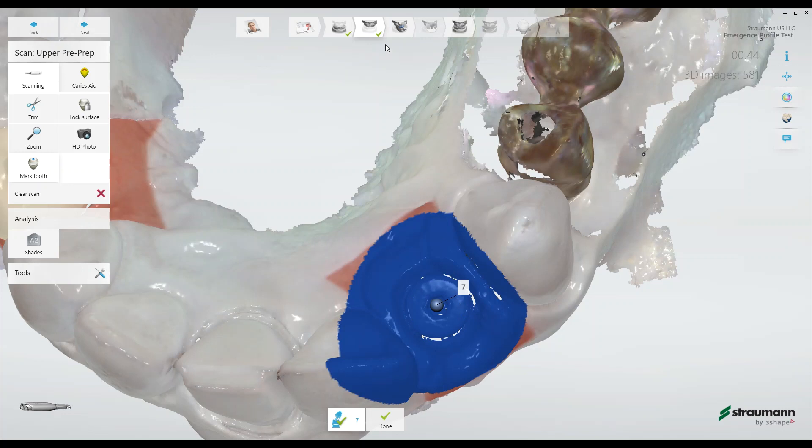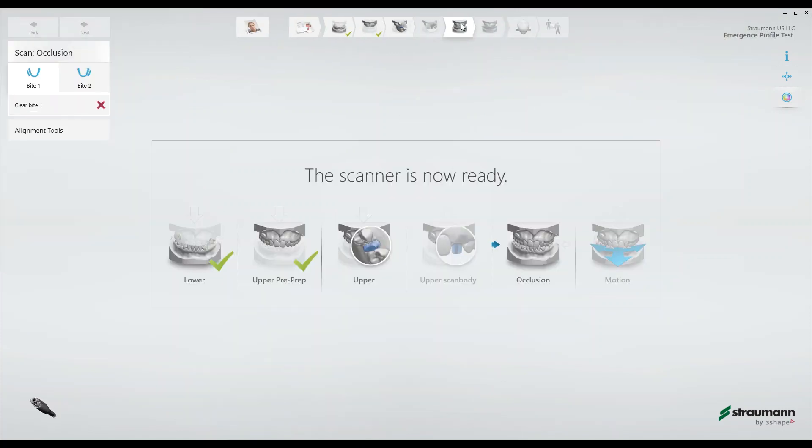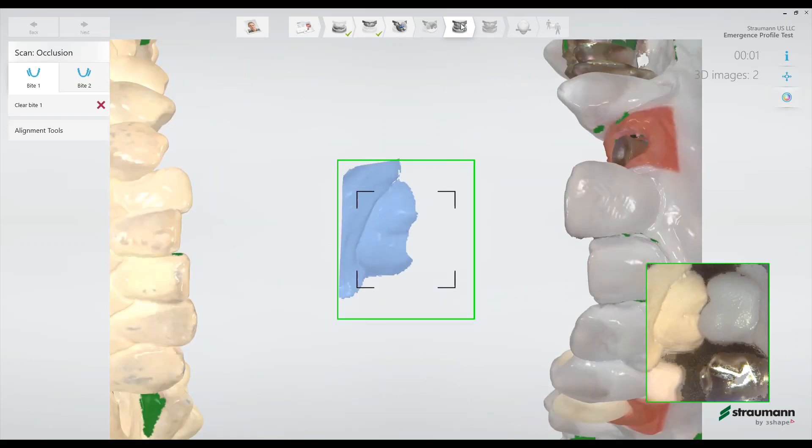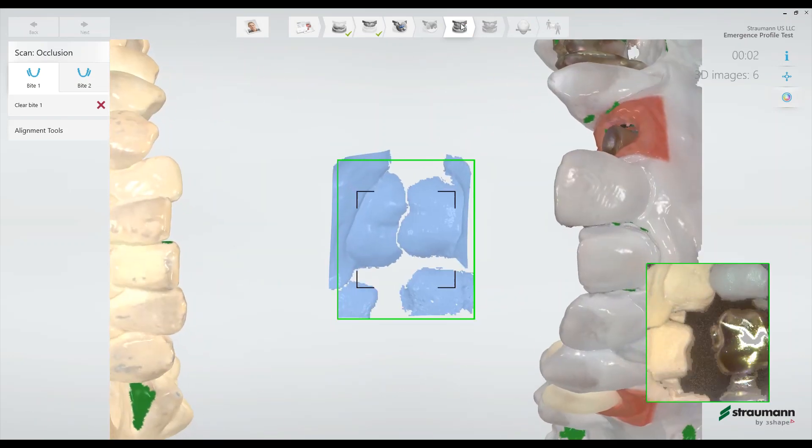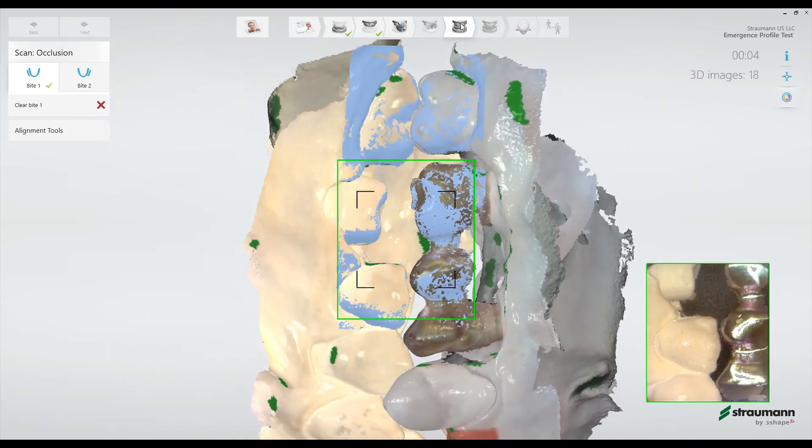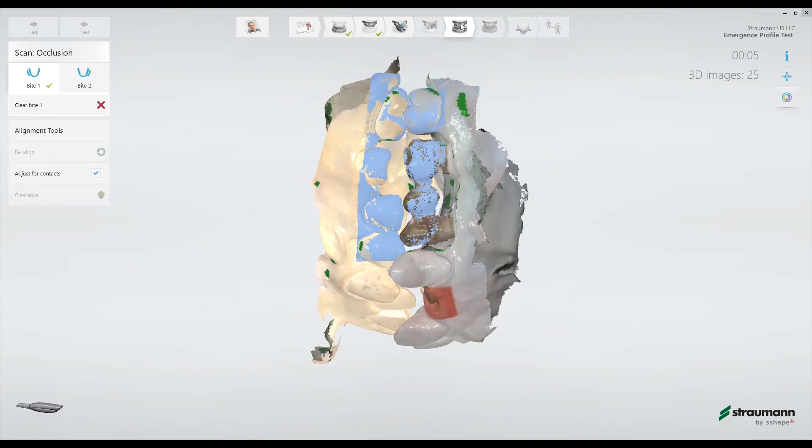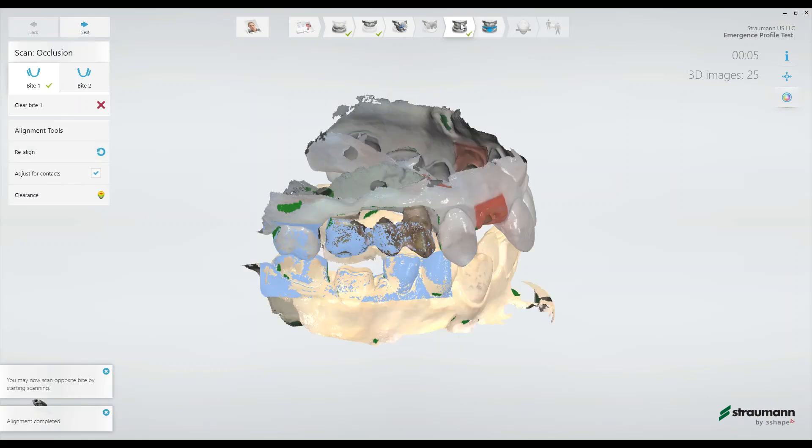At this point, we'll skip to the occlusion. And then we'll scan the opposite side of the occlusion.